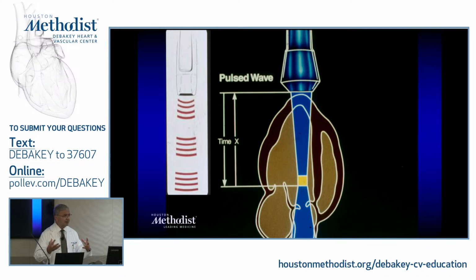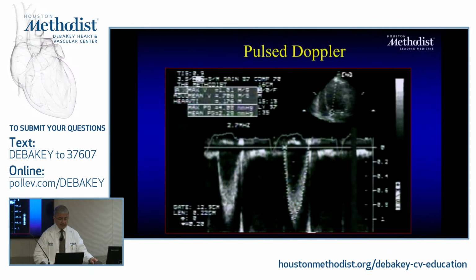And it's not easy, because whatever signal you're getting back, you have to use a fast Fourier transform analysis to try to understand what these frequency shifts are and therefore solve the Doppler equation. Okay? So pulse Doppler is actually, I know where I want to get it. I want to know what the velocity there is. One problem with it, if the velocity is very high, I'm going to have what's called aliasing, because I won't be able to resolve it.